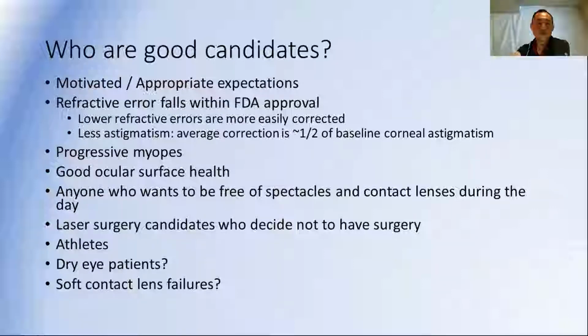You can fit this on anyone who wants to be free of spectacles, maybe patients who considered refractive surgery but really did not want to go through a surgery. Athletes, it's great for athletes, especially swimmers, or people who are in the water all the time, because we know that being in water with soft lenses especially increases the risk of eye infections.